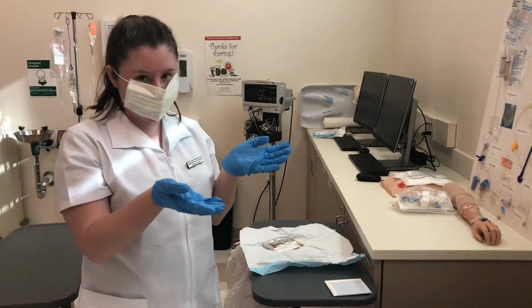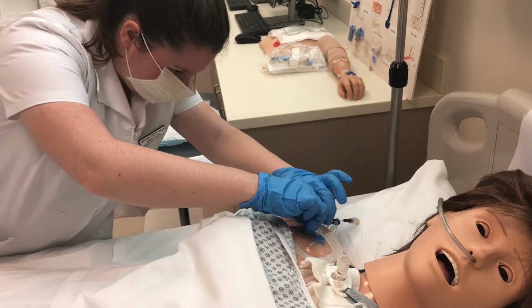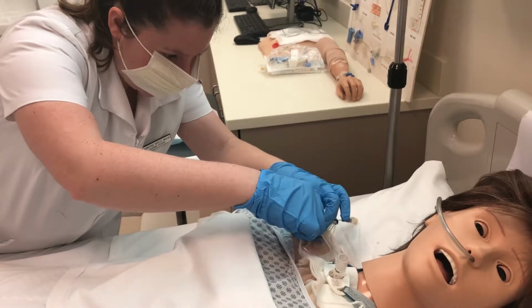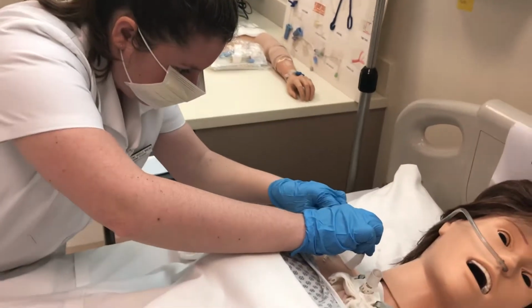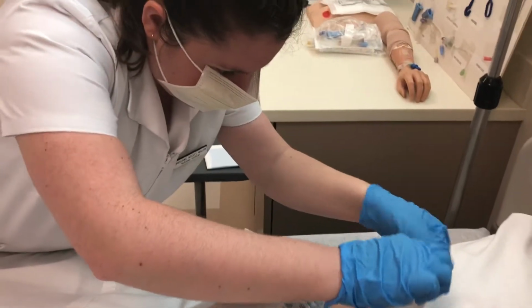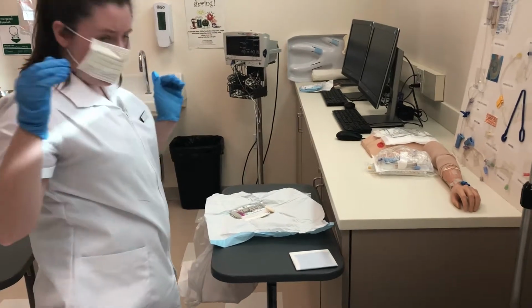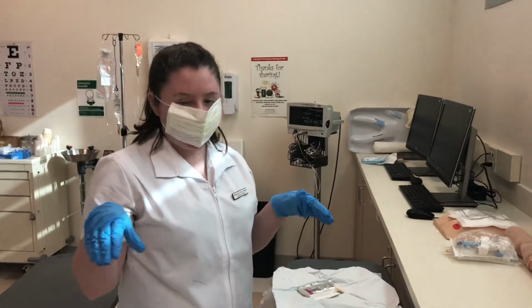I'm ready to take the old dressing off. And I'll do this carefully. I don't want to hurt the patient's skin. And all while I'm doing this, I'm asking the patient if they're in any pain. So my old dressing is off. I'm going to put this in the garbage, and I am going to take my clean gloves off now and put my sterile gloves on.